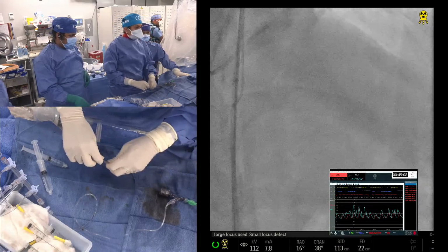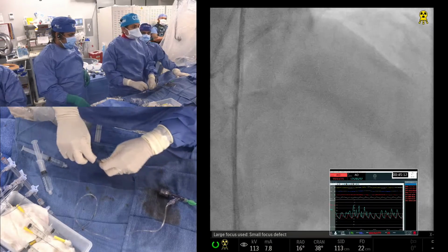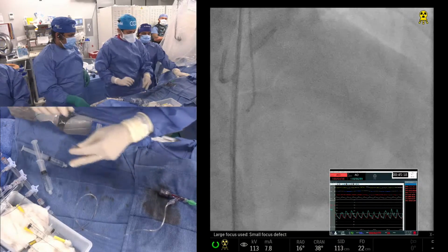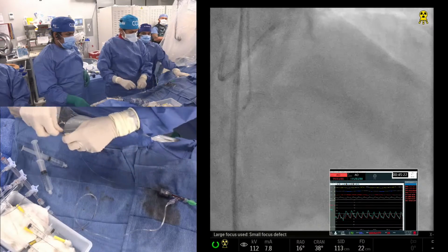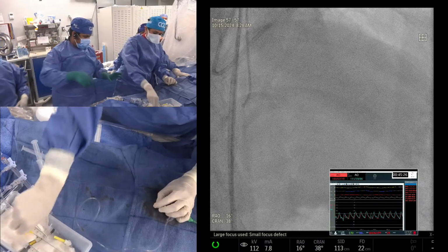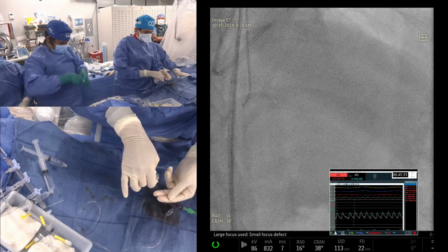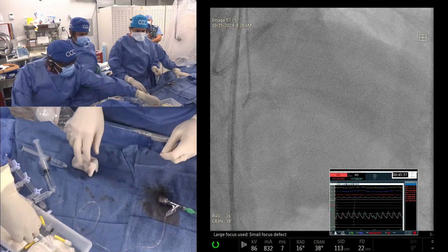So we're going with the 2.0 by 20 compliant balloon now. Any questions there? Not so far. I think people are just concentrating, and a few may have even gone and opened the guide wire. Can you ask him the hemodynamics should come here? We cannot see that. Thank you. My other observation is that the IVUS is ready. Most people start joining in the middle of the case, a little later.